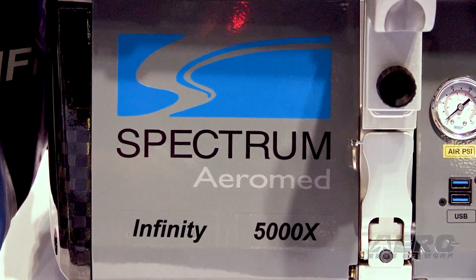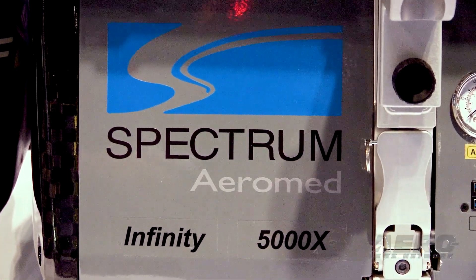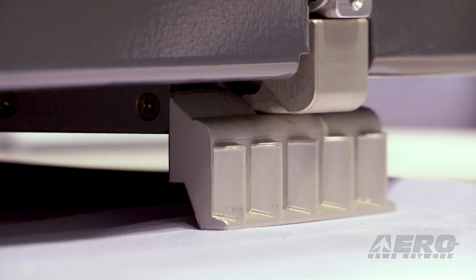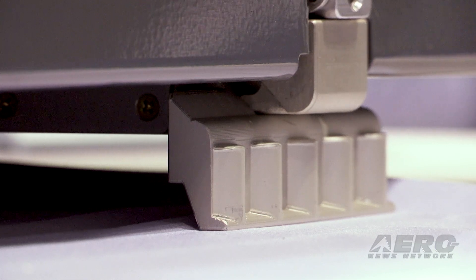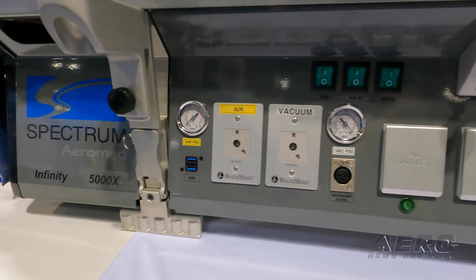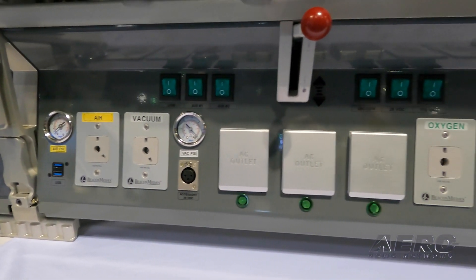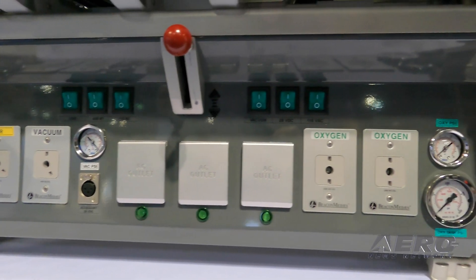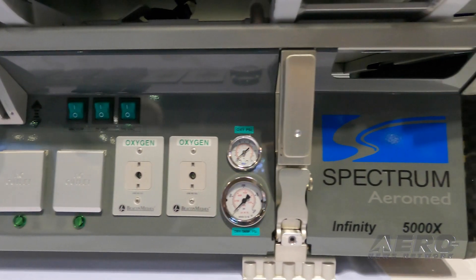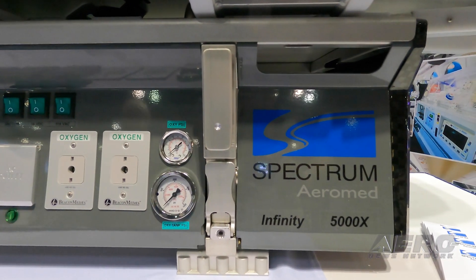For our system, we're typically attaching to an aircraft's seat track or a hardpoint, and it used to be a separate piece of equipment that would do that. We'd have a floor rail adapter that would go onto the aircraft floor first and then our system would lock onto the top of that. We've taken that floor adapter away and incorporated it into our base system, so for the mechanics it's an easier step, it's an easier process.